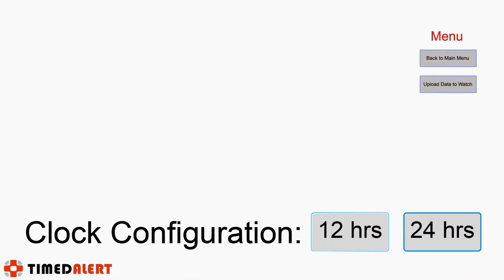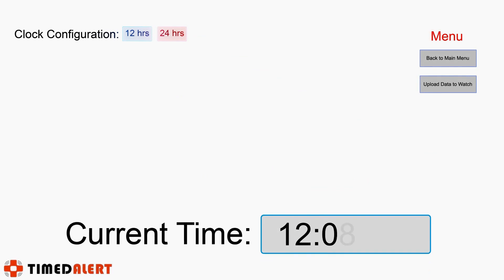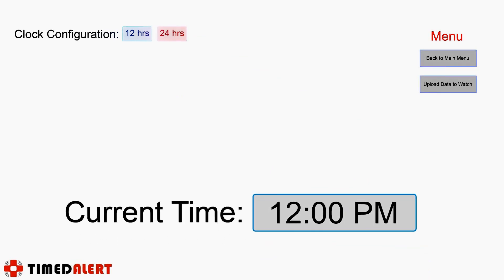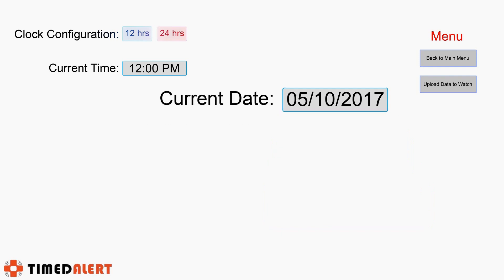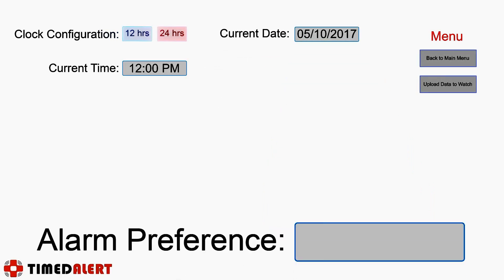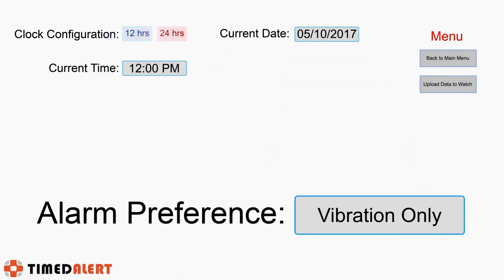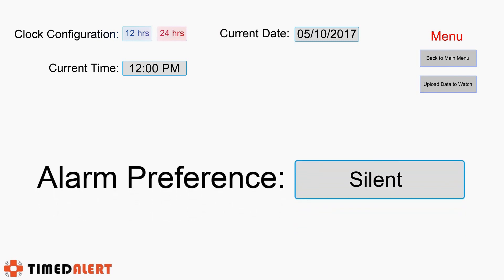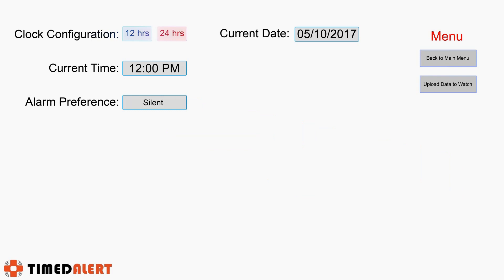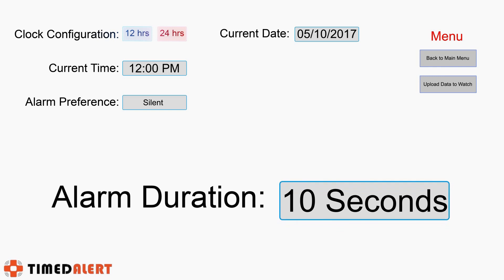There, you can select a 12 or 24 hour clock, enter the current time, enter the date, and set an alarm preference to audio and vibration, audio only, vibration only, or silent. Additionally, you can set the duration of the alarm to be 2, 5, or even 10 seconds.